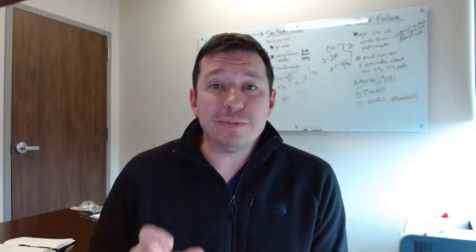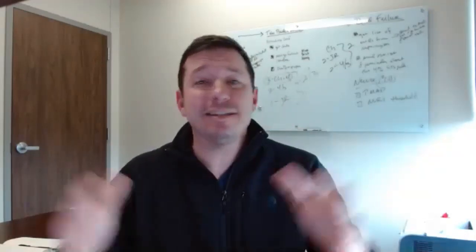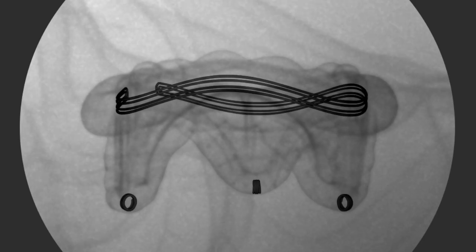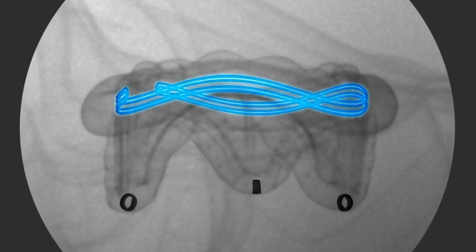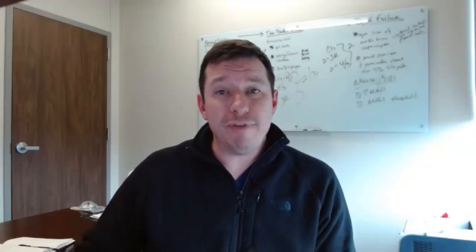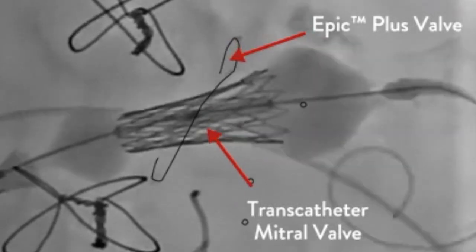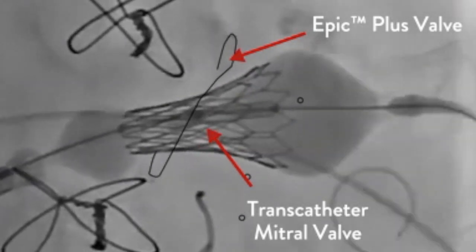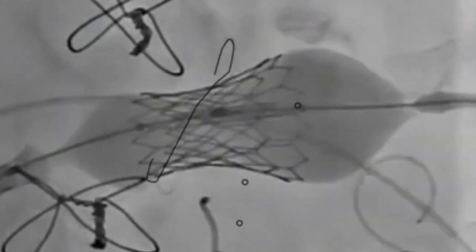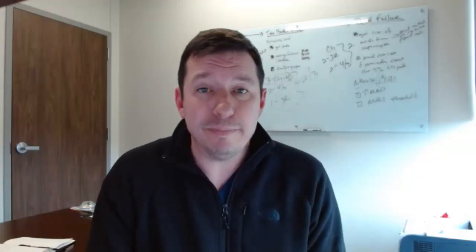The valves themselves now, with this idea in mind of, hey, this valve is not what God gave you. It's not going to last as long as what you originally had. But what can we do to manage this? They've put some markers in there so that when we're putting a transcatheter valve in, which means a valve that we go in through the vein of the leg, come over and cross over the inside of the heart, and we deposit that valve right where the other one is, we use those markers to help position it right where it needs to be.